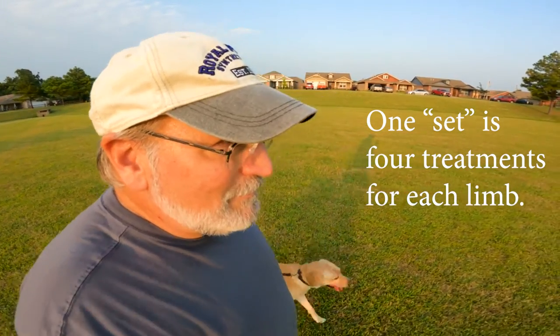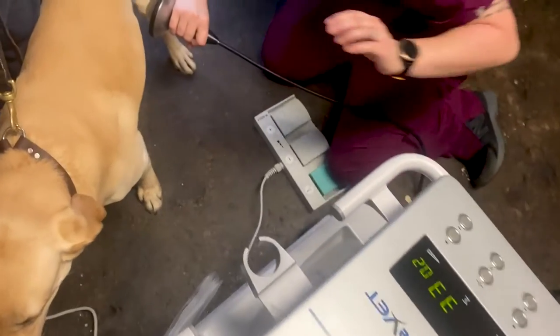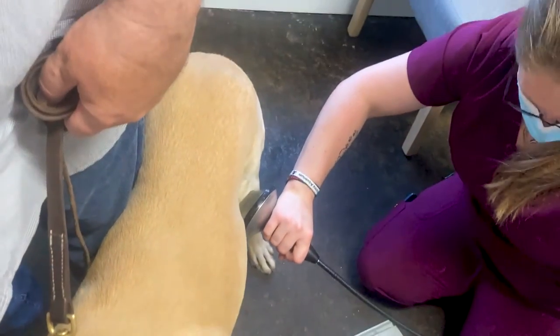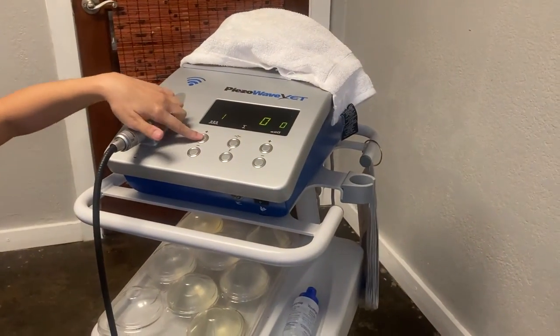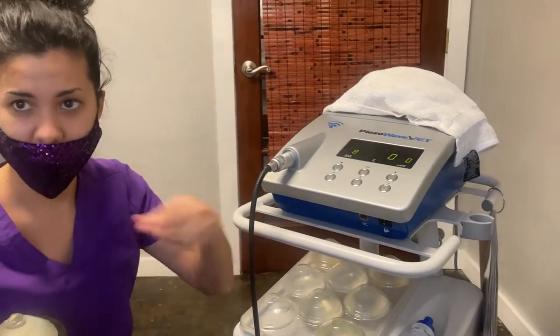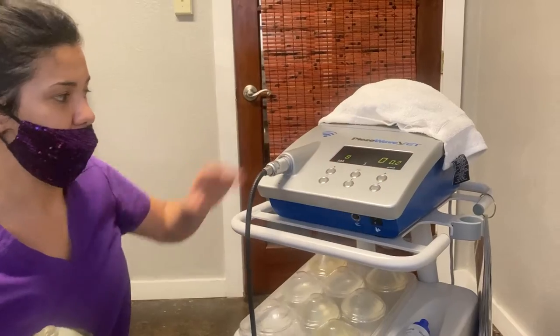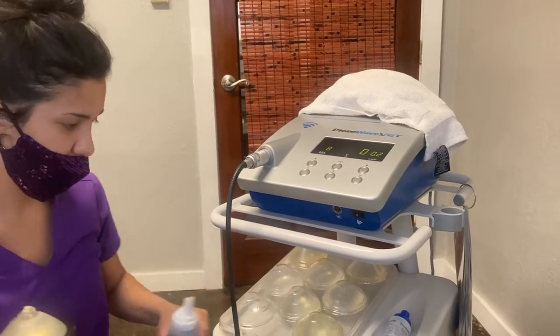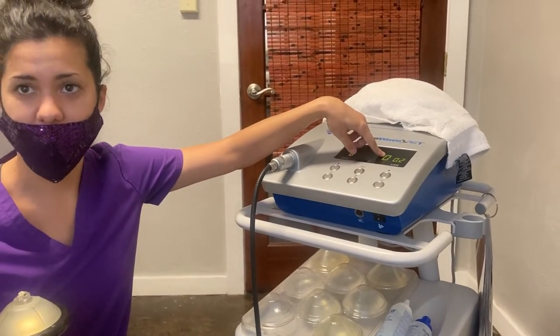He's gone through two sets of it now — some of it for his right rear knee and also on his front shoulder. This number right here is the speed, the number of shocks per second. This goes all the way up to eight; we're going to go fast to get her out of here quickly. This is the power, which I'll manipulate based on her reaction. And this is the number of shocks she's going to receive — we're going to give a thousand to each location.